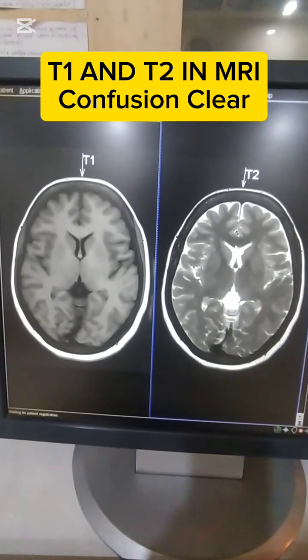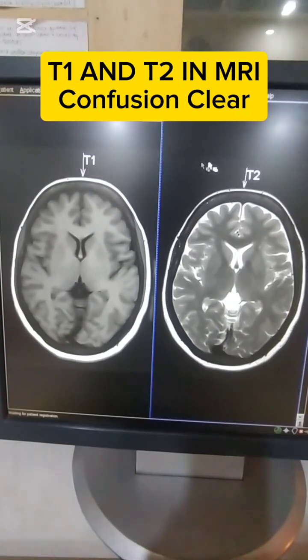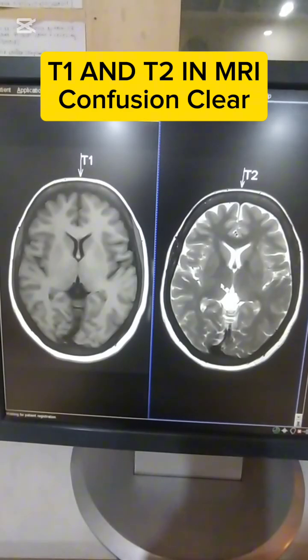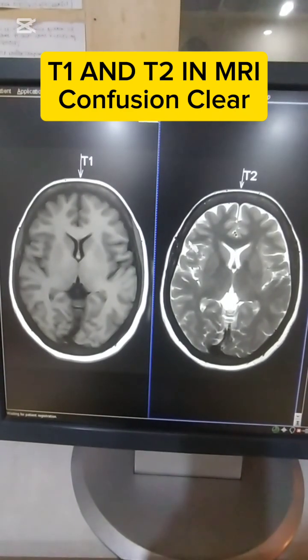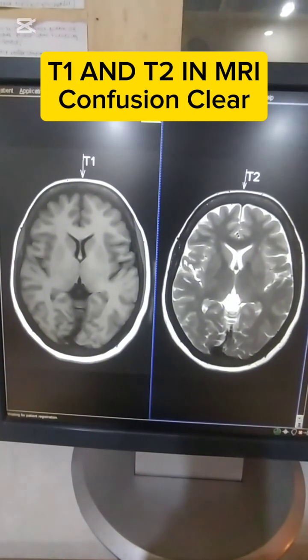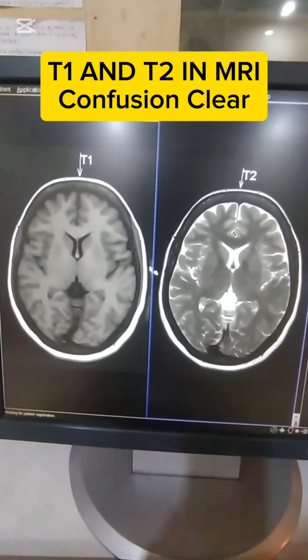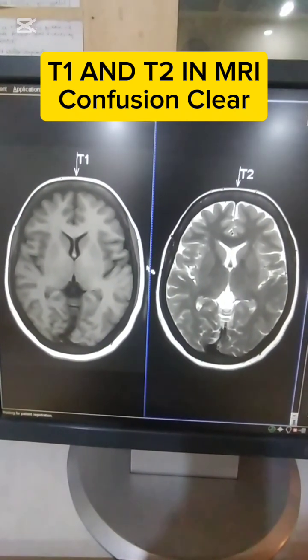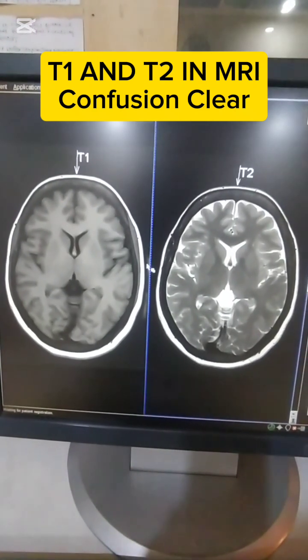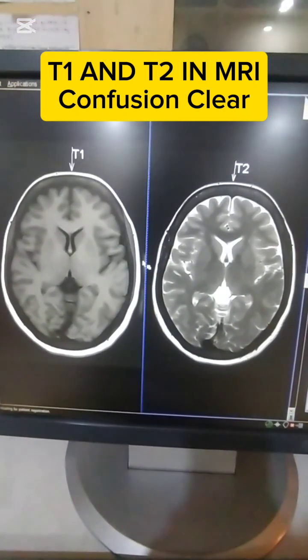I hope you understand the process. Always remember that T1 and T2 are timings, and the timing is of two relaxation processes in a tissue. Every tissue has two relaxation processes after the radio frequency pulse, one is T1 and the other is T2, and MRI protocols use these timings to create different types of protocols and make the contrast differences between the tissues. So thank you very much.